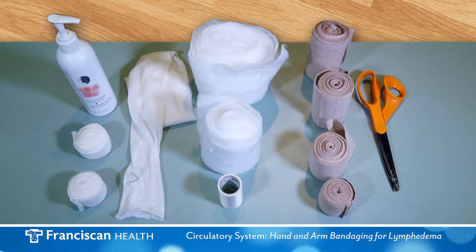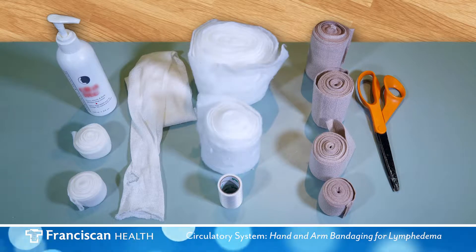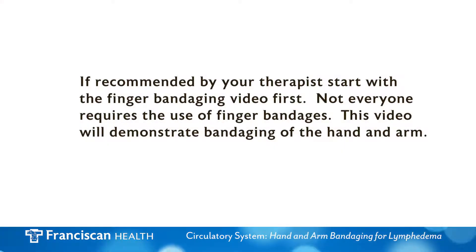Your therapist will make recommendations for your bandaging supplies. For the purpose of this video, we will be using these supplies. If recommended by your therapist, please start with the finger bandaging video first. Not everyone requires the use of finger bandages. This video will demonstrate bandaging of the hand and arm.